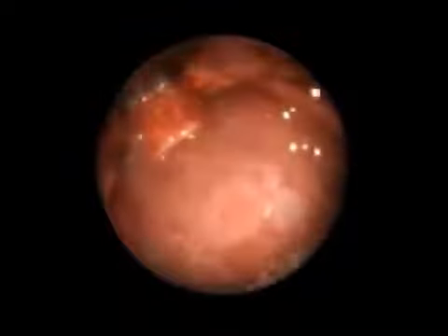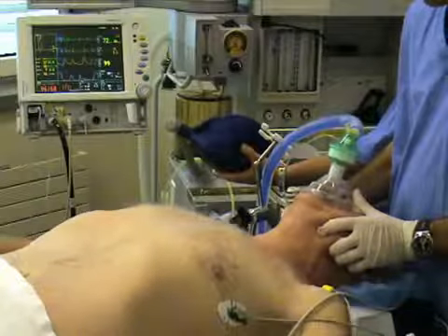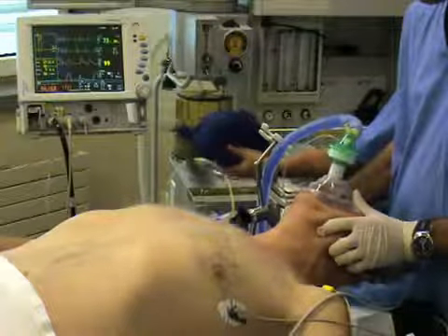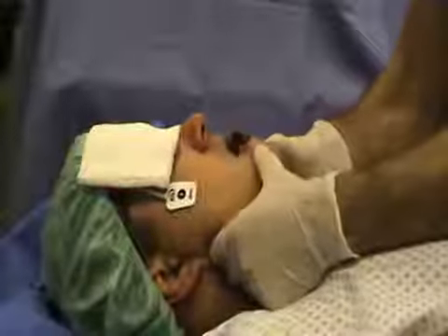If you find it difficult to visualize the larynx of a patient who is already anesthetized and have attempted conventional intubation without success, use bag and mask ventilation to maintain oxygenation. Then place a slit airway in a midline position. Ask an assistant to perform the chin lift and jaw thrust maneuver.